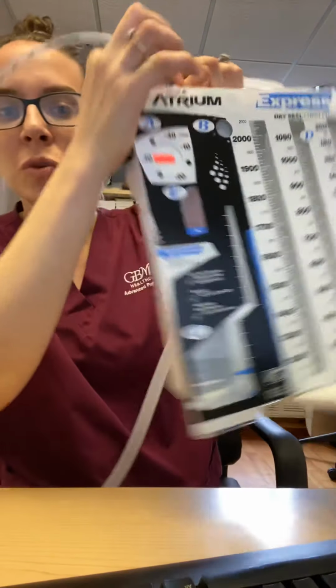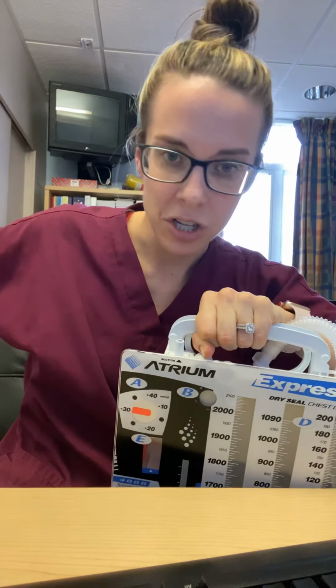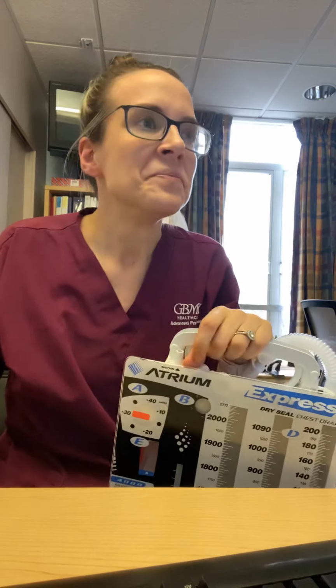I will put my shoes on this stand and use that as leverage to pull off the suction tubing. Other than that, I don't really use it.